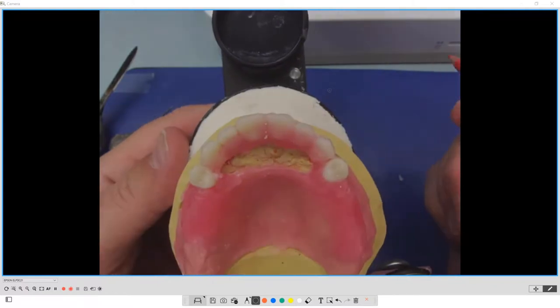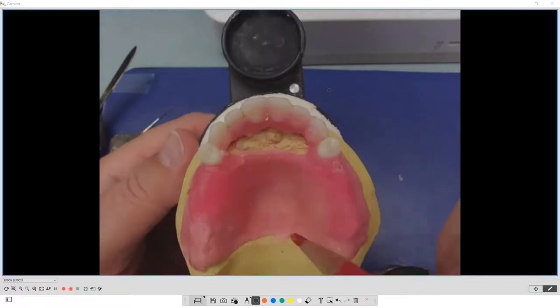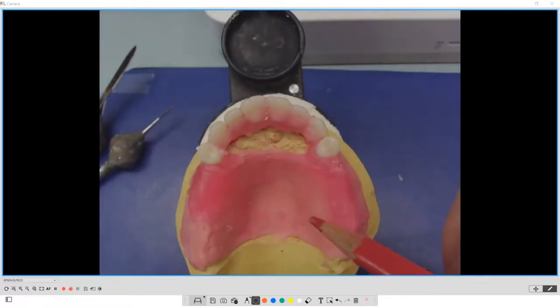So I'm able to adjust positioning so that the teeth are going to function properly for this structure of this patient. So it's actually pretty cool. And that's what model analysis does. It allows us to set teeth into that position. And that's what becomes really important, in the position that's suited for that person. So this isn't cookie cutter.